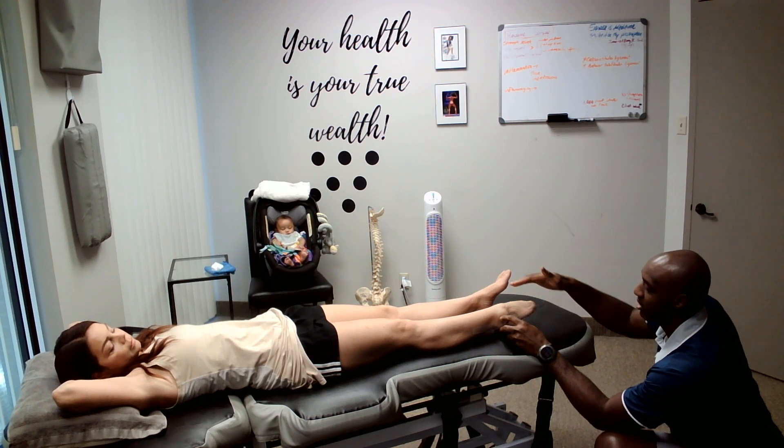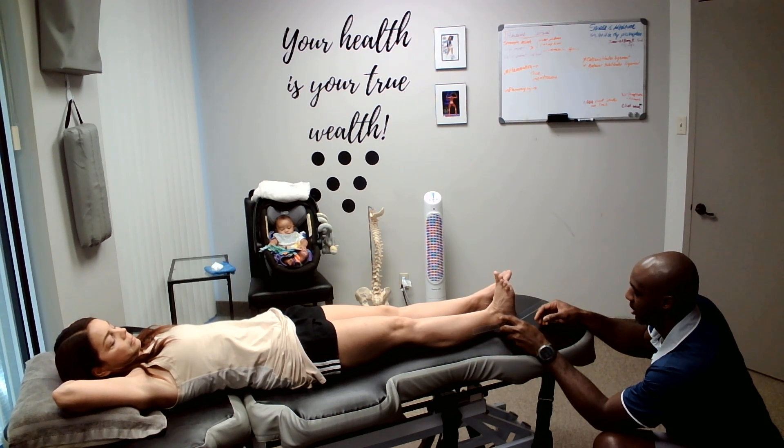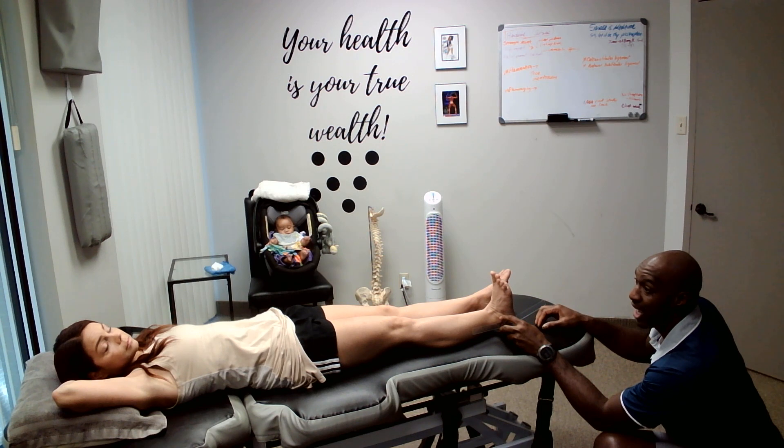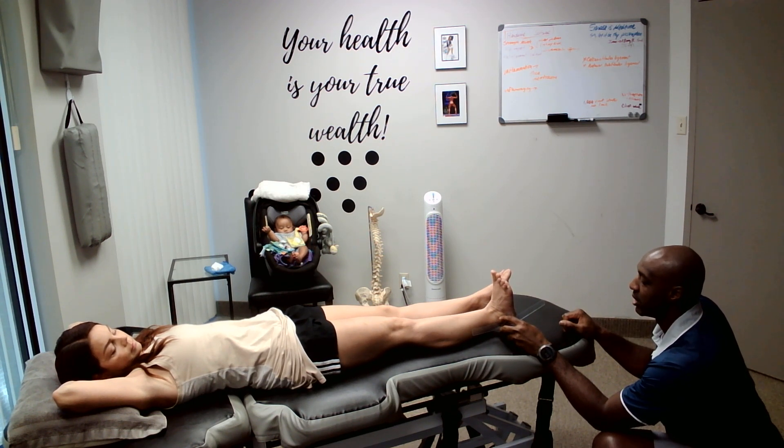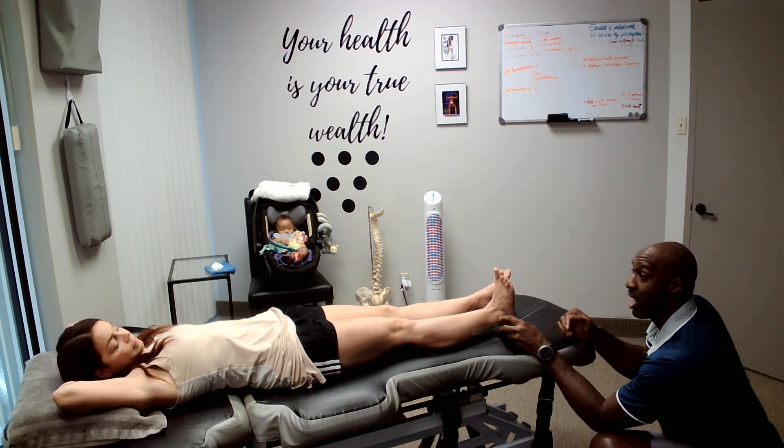So that's going to be our starting point. Now you're going to try and take this as far as you can towards your knee. I'm going to have you do that two times. Come back down. Go ahead and do that one more time. And the third time, I'm going to follow you.